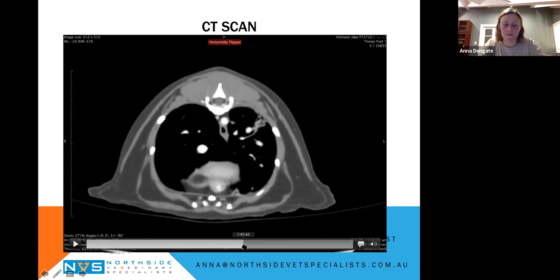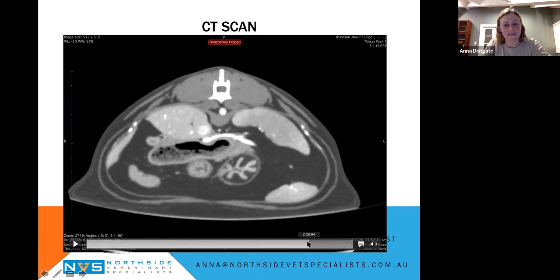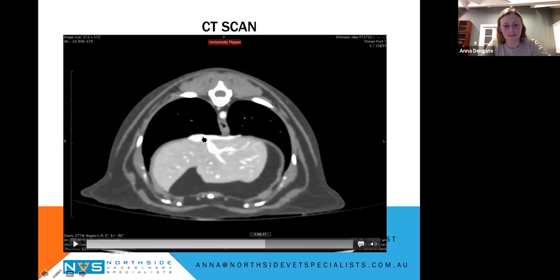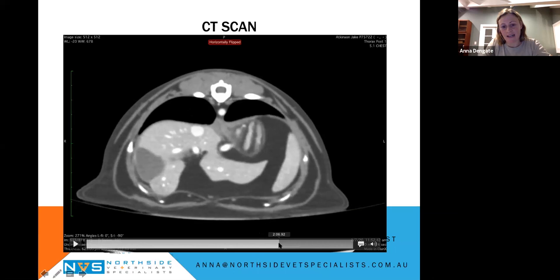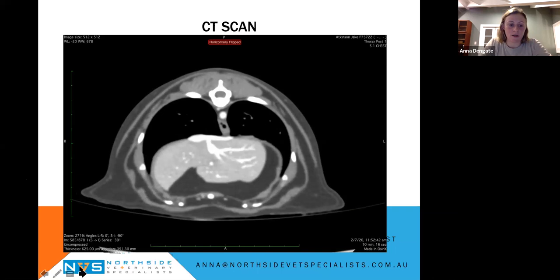As we scroll through the CT scan to get to the abdomen, fortunately, our very clever radiologist, Mariano, has noticed, oh, this is going to stretch my CT knowledge. Have a look at this vessel here. So phrenic vein, I think. And then a vessel diving off the side of that and joining onto the gastric vein. So this cat has a left gastrophrenic portosystemic shunt, despite having no biochemical or clinical symptoms of a shunt, historically or presently.